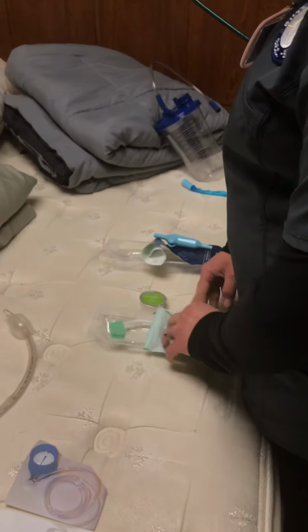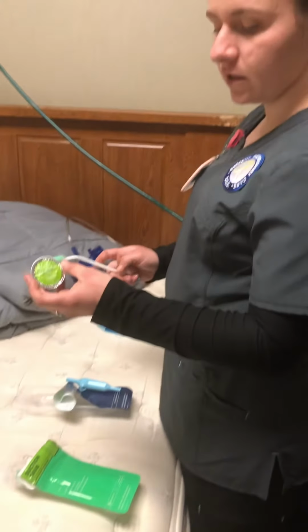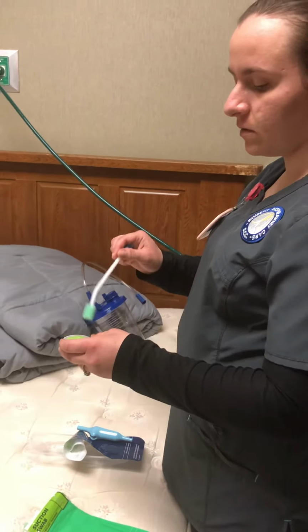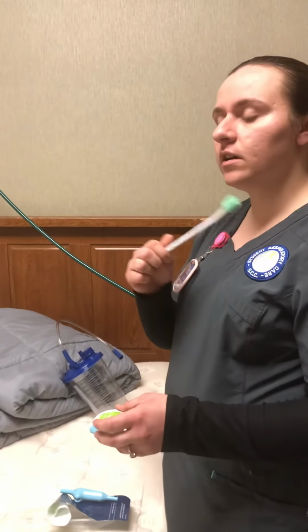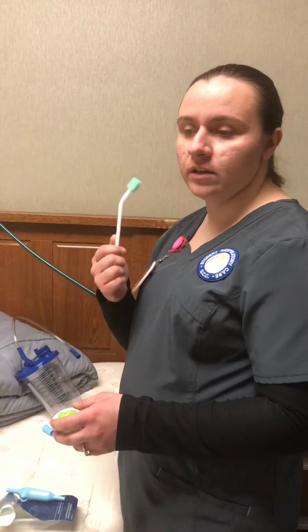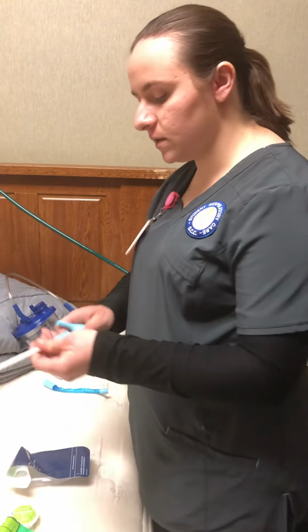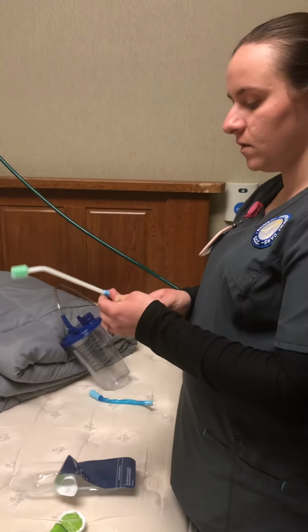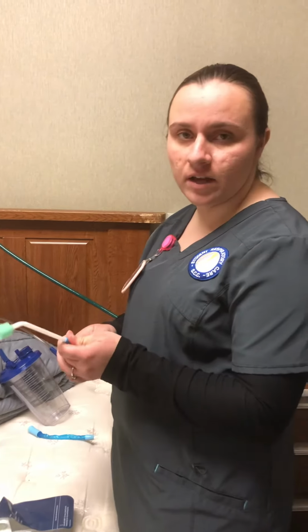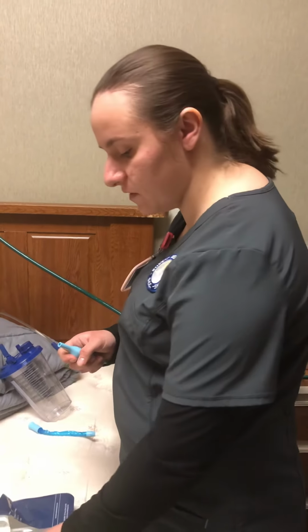So when you're doing your oral care with a patient, this one here, we have a suction swab. You're going to dip it in your oral agent, and you're going to get it around the gums, on the tongue, anywhere where you can get a buildup of anything. So when you're done, you can also connect this to your suction handle, and you can suction out any of that excess oral agent that you may have left in there, and dispose of that.